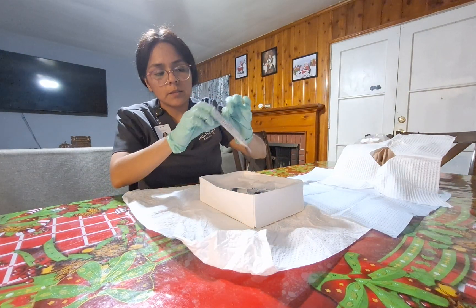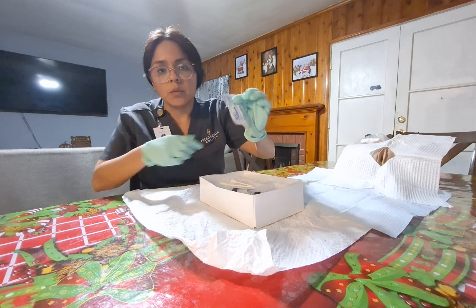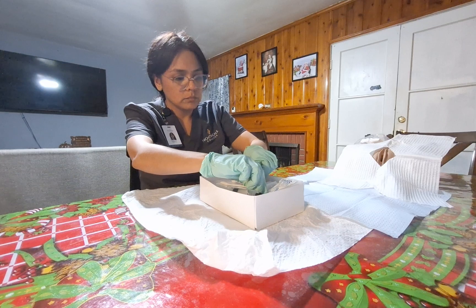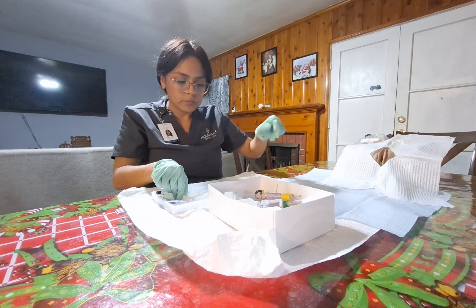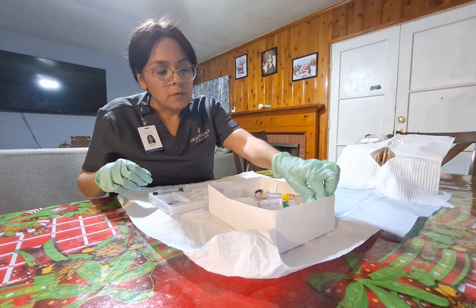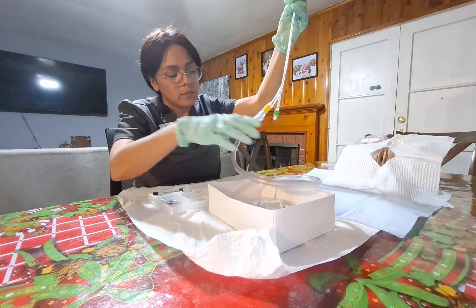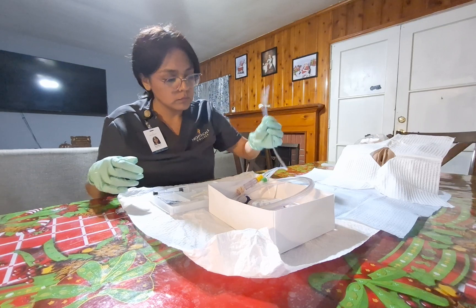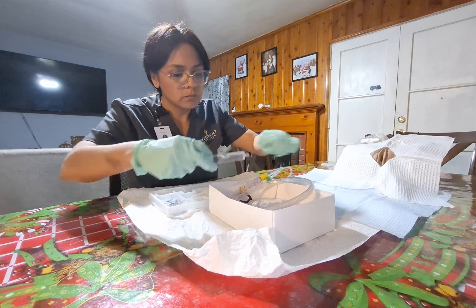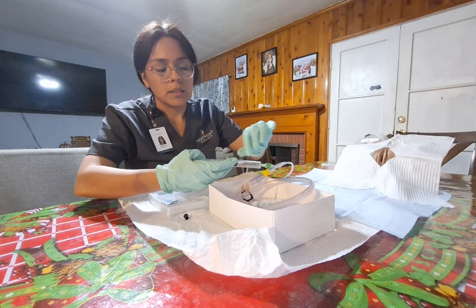I will pull out my alcohol swabs. I will open the lubricating jelly. I will get the Foley catheter from the kit box and loop the tip. I will attach my syringe and verify that there are 10 mls of fluid in here.